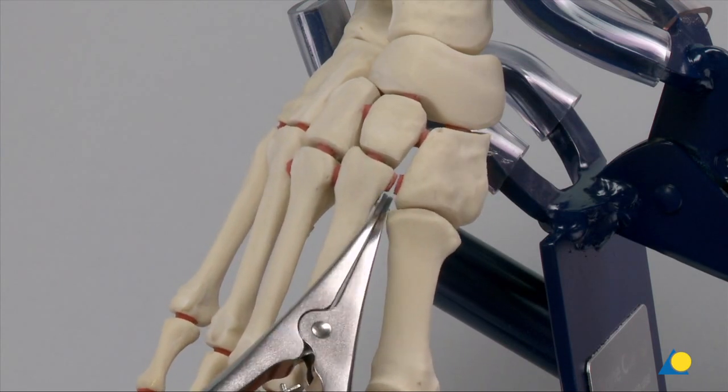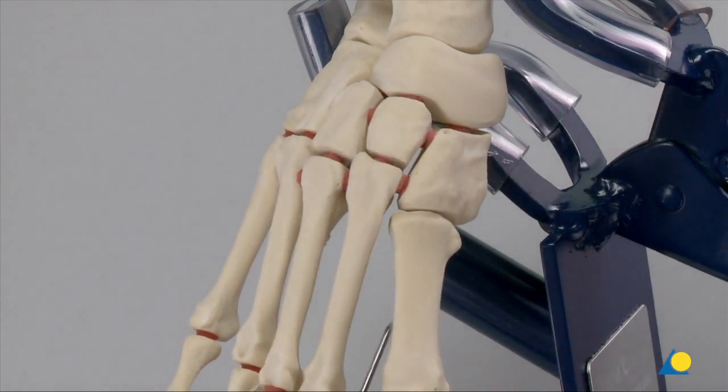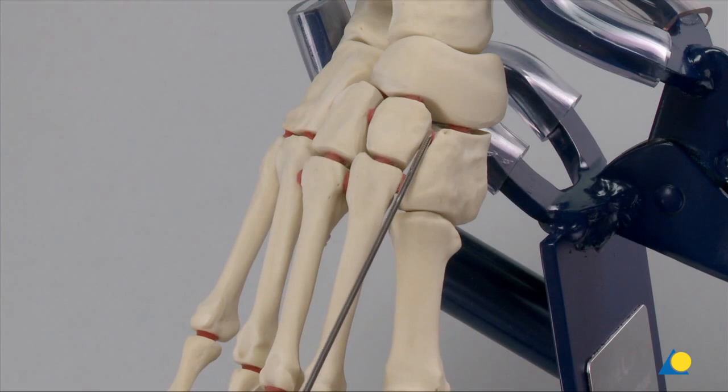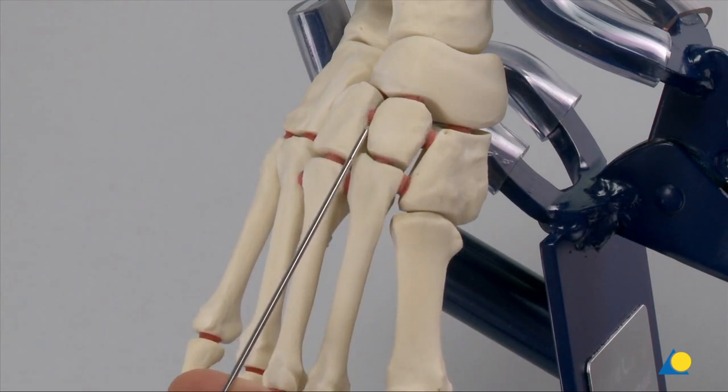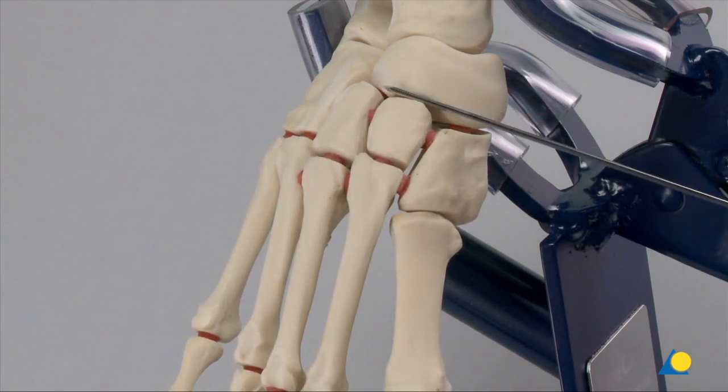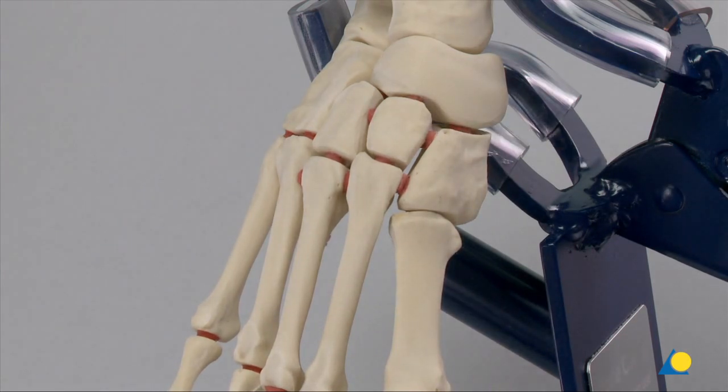If there is additional instability more proximally, it would possibly be in the region of the intermetatarsal area between medial and intermediate cuneiform, between the middle and lateral cuneiform, and even along the navicular cuneiform level. This additional instability must be addressed before a definitive ORIF can be completed.